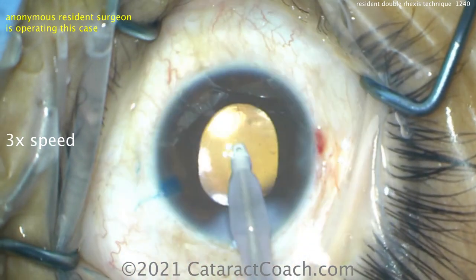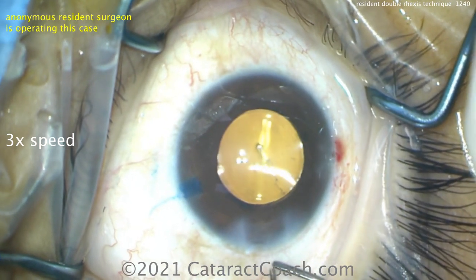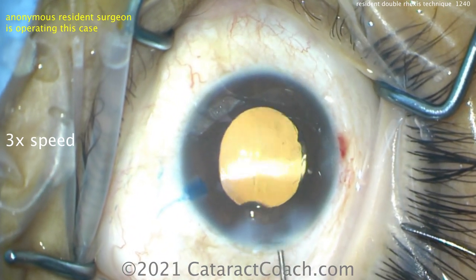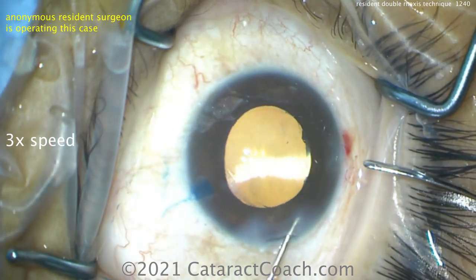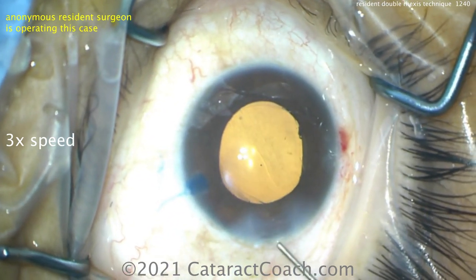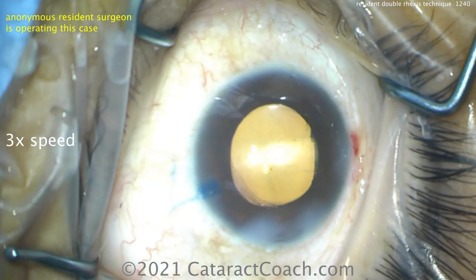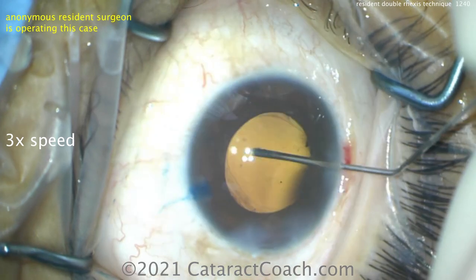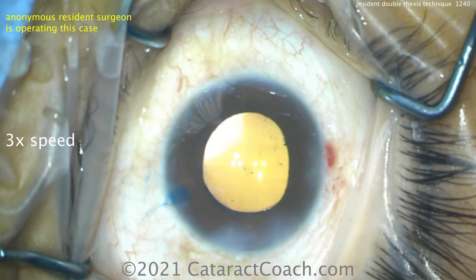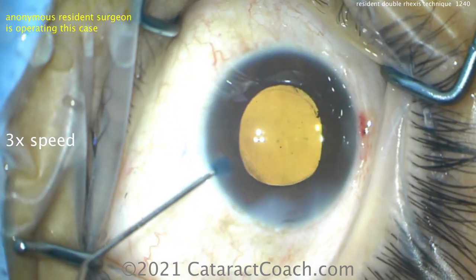Should you spend a lot of time polishing up that capsular bag? Certainly get out as much of the lens material as you can, as many lens epithelial cells as you can. But there's a balance here — don't break the capsular bag, and just think of the patient's delta, the difference between the before and after vision. If there's a little bit of capsular haze on the anterior capsule rim, that will not diminish this patient's happiness or satisfaction in any way. And when you're learning, we can save some things for further along in the bell curve of learning.